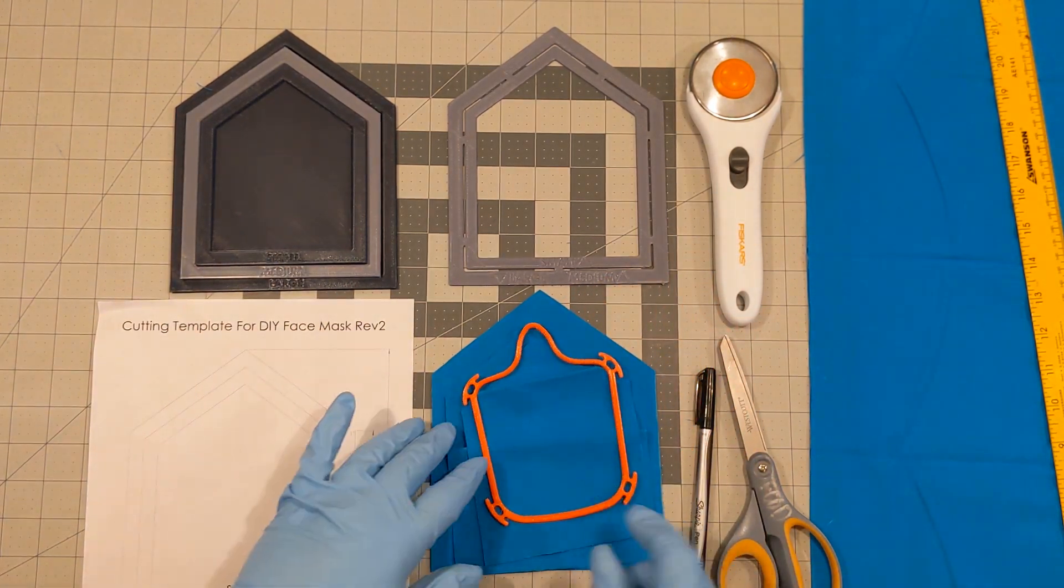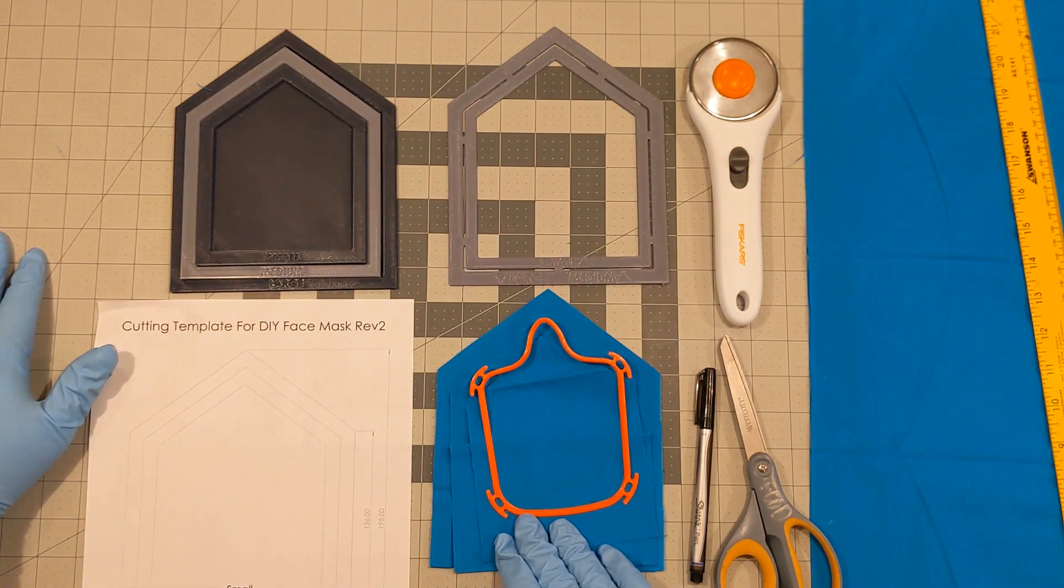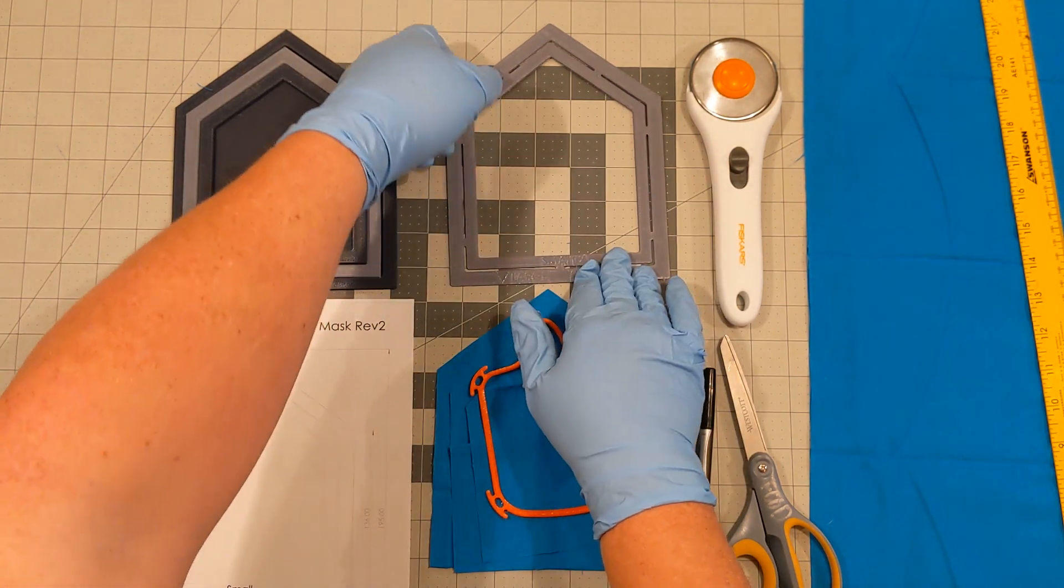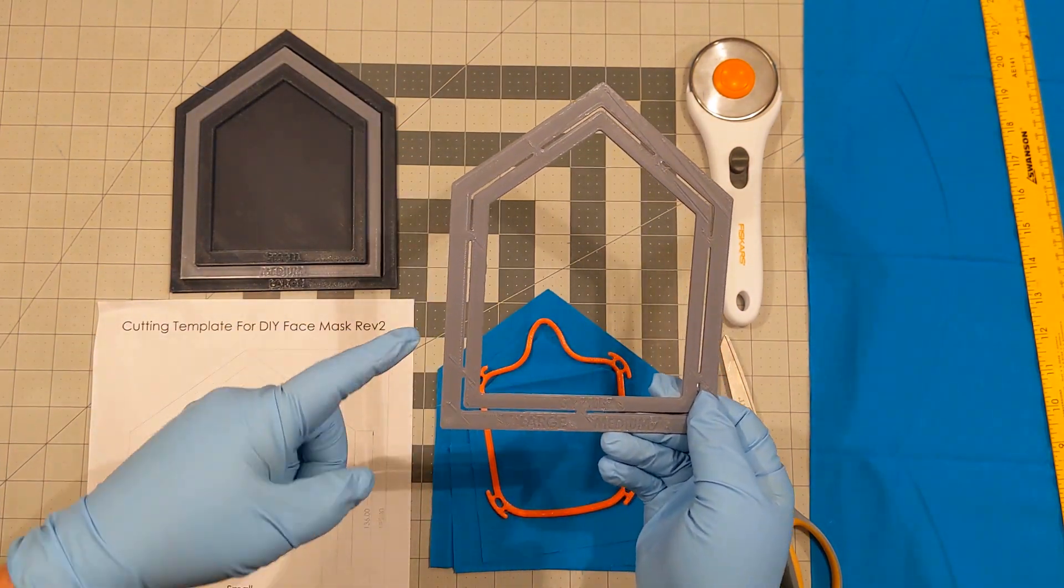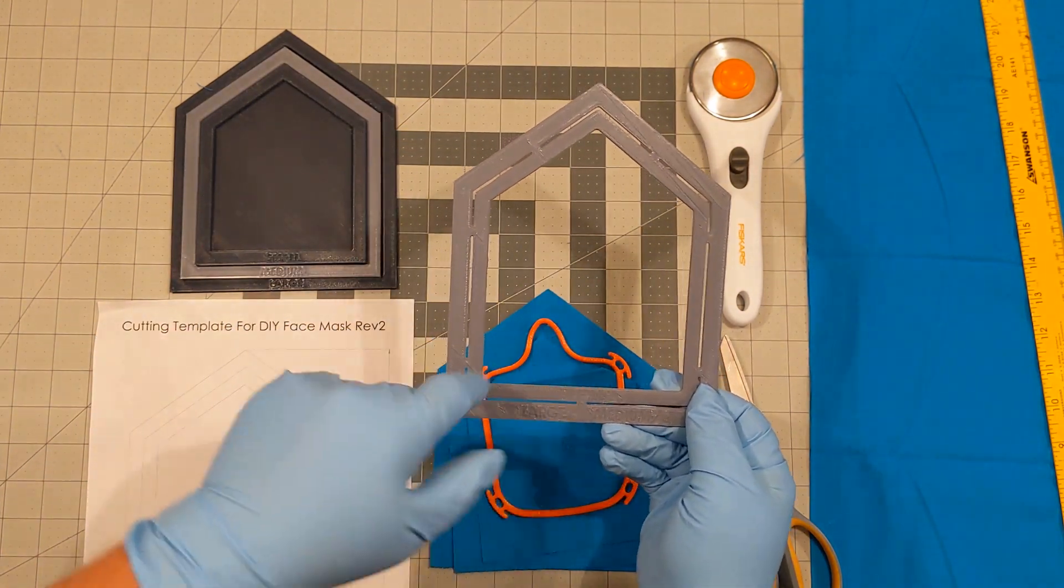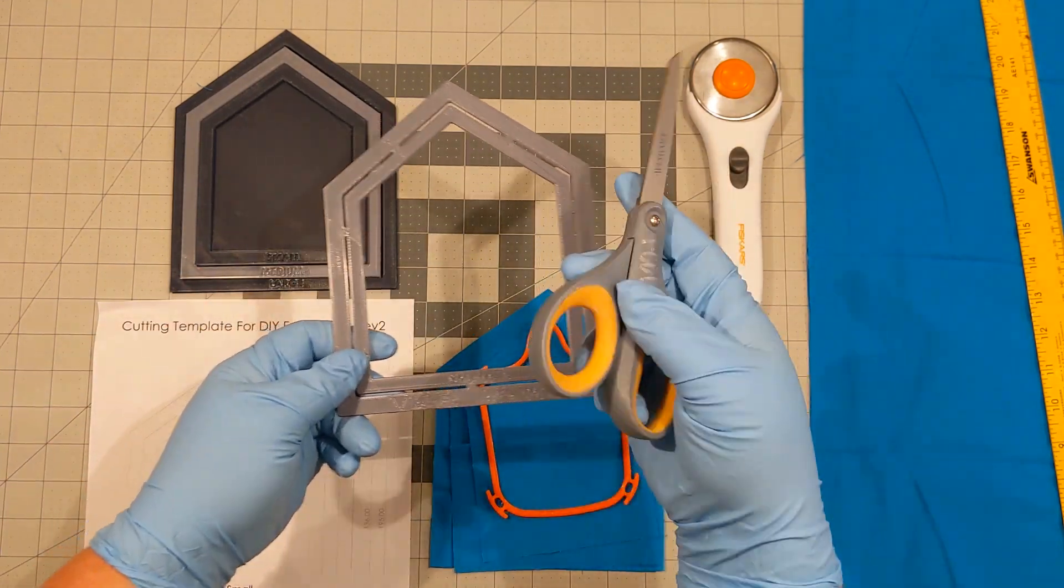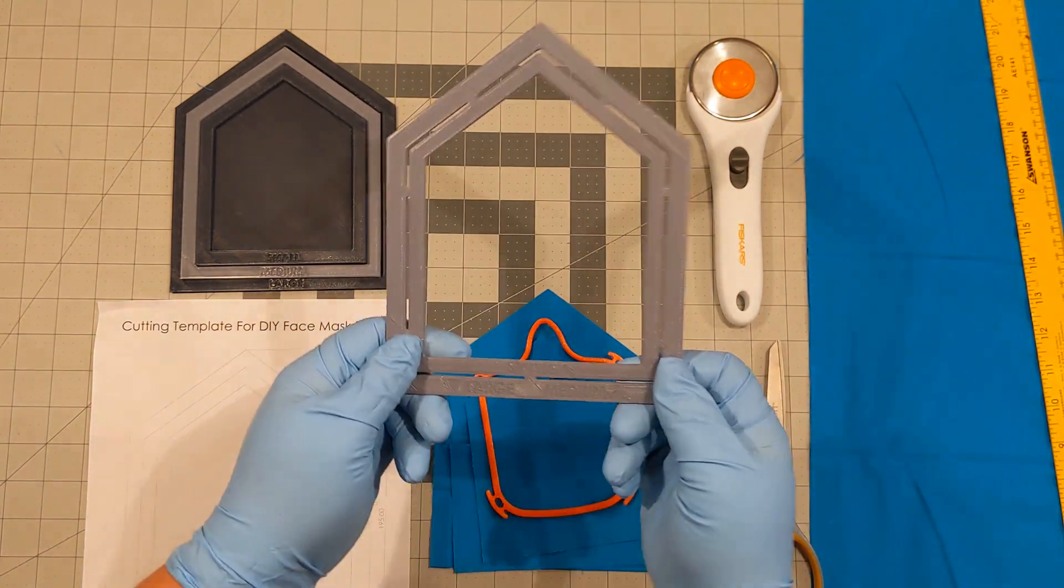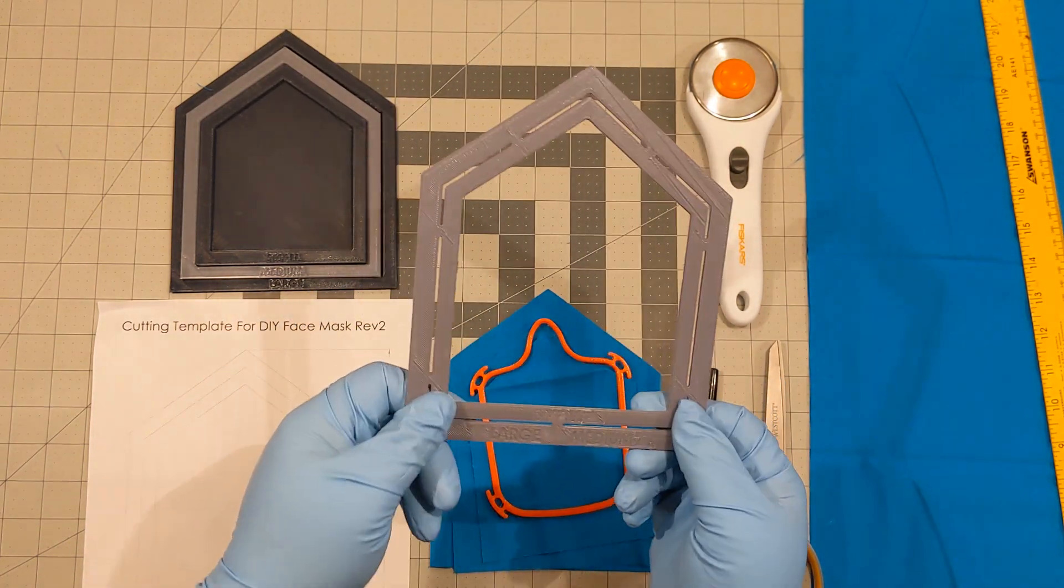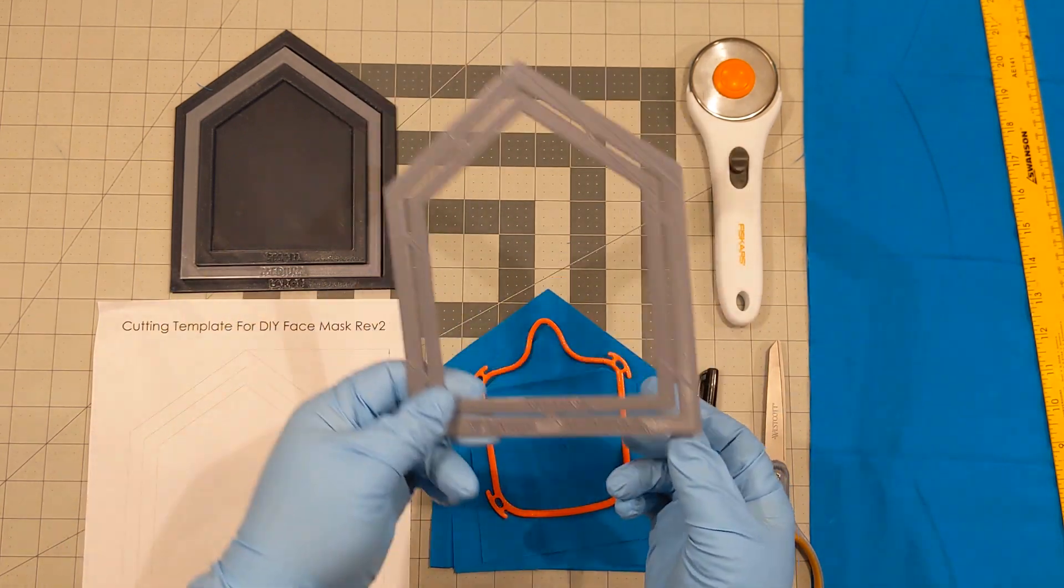There are three different methods of how to cut out the filter material for the frames. The first method is the trace and cut. This is a great tool. It has large, medium and small. So you'll lay this down on the material, trace it out and then use scissors to cut it out. If you're only doing a couple of masks, this is a great option. It's quick to print, takes about an hour and you can do large, medium and small all in one tool.